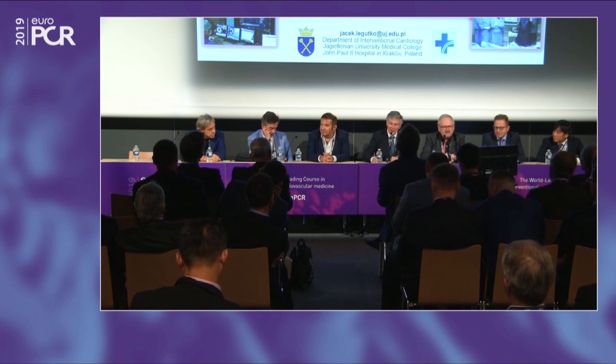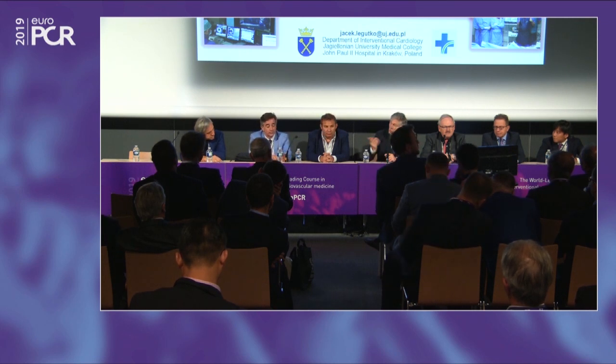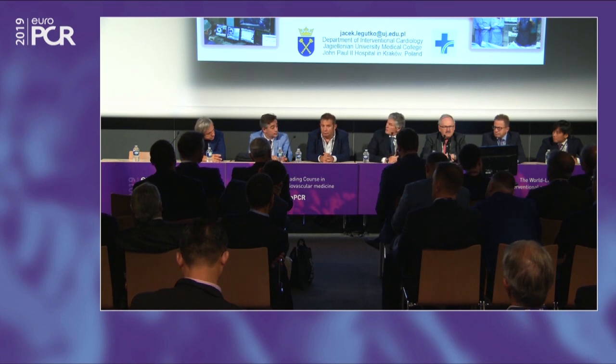Yeah, I fully agree with that. I think it's very important. So it's a way to simplify the procedure. I'm not completely sure that the pot with a 5-0 balloon would be necessary, because you can increase the pressure with a balloon and do the automatic pot with a BiOSS. I think it's very nice.